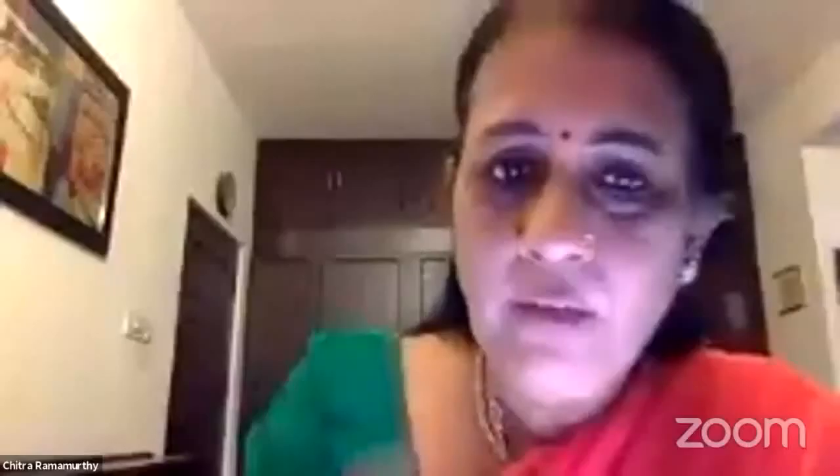Those were wonderful take-home points on the challenges with the femto cataract platform. A question to you: would you believe in having a pupil-maximized scan or a scanned capsular bag capsulotomy? We usually do a pupil-maximized scan unless you expect some amount of subluxation, in which case centering onto the bag makes sense. Otherwise, pupil-maximized works well for us.